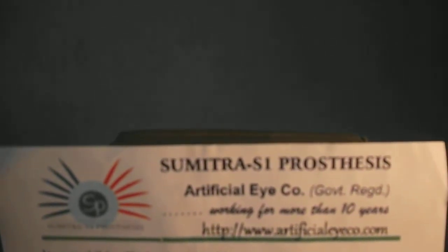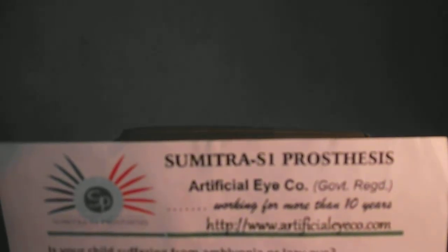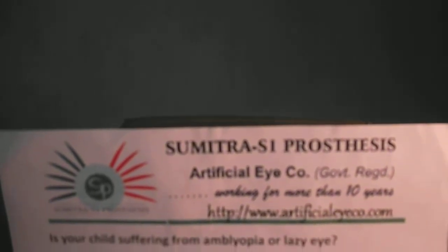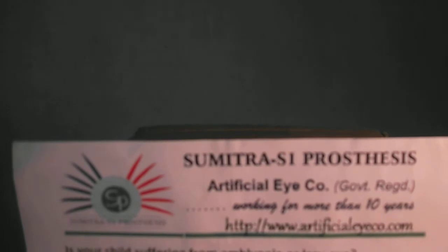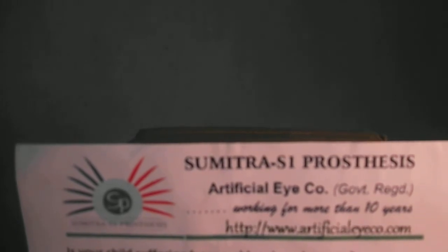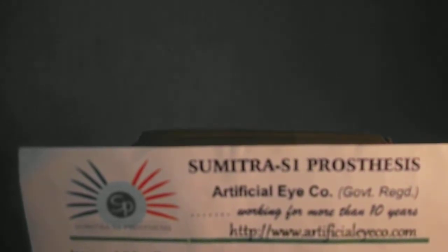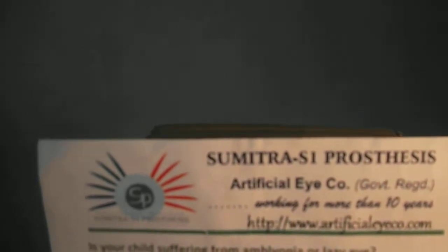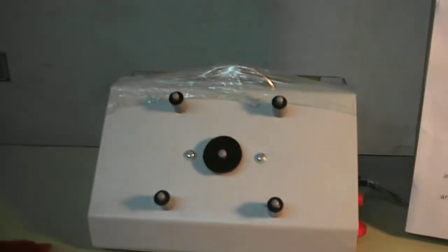Hello everybody, this is Sumitra S1 prosthesis. Today we will understand the description of the vision stimulator. So here it is, this is a vision stimulator.